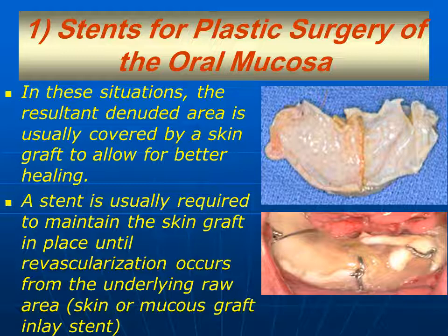Otherwise, flap necrosis can occur. That's to say, necrosis of the graft and we lose it. Therefore, the stent provides a very important function in these situations.